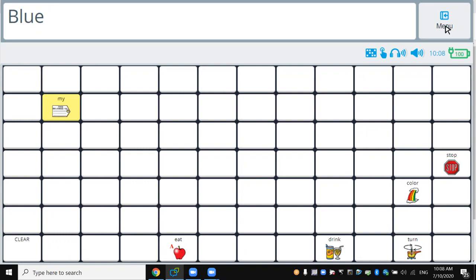But like I said, oftentimes it's a word you don't know where it is. So in the middle of this activity, I have a child who wants to say happy and sad. It doesn't make any sense. Or fast and slow. Whatever it is, it's a word I may know that's in there, but I don't know where it is, so I can't use the on the fly method. So I'm going to teach you 2 ways to do this, and they're both really slick.